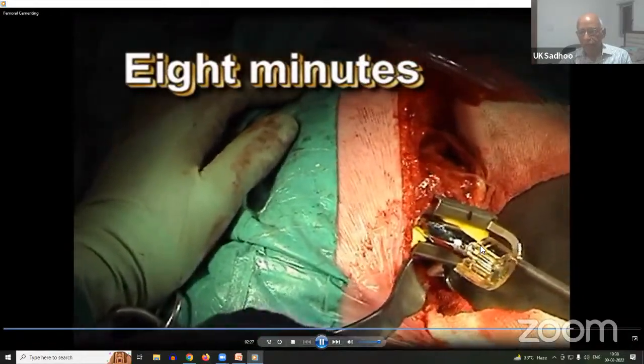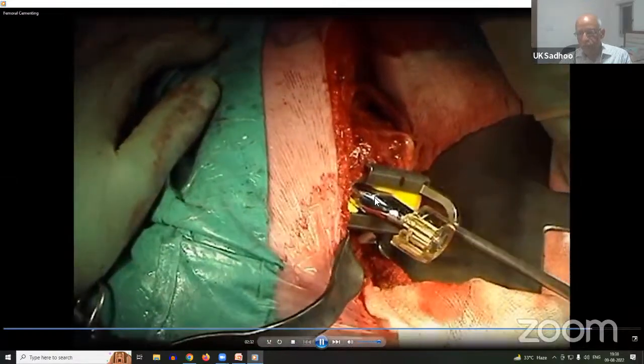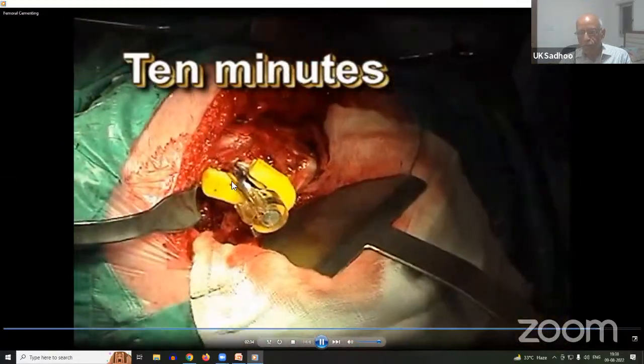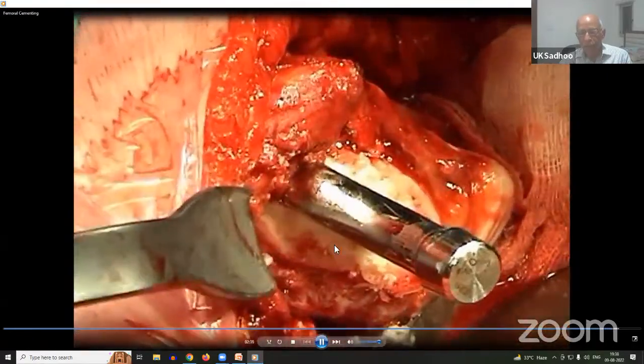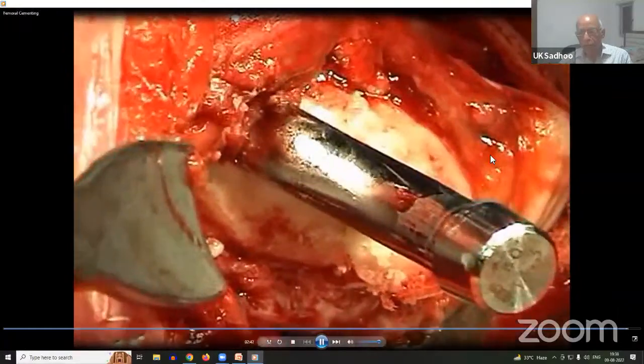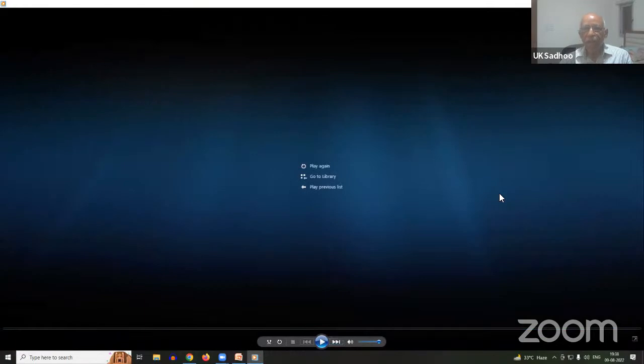And he has still not given up. He is still pushing with a U sort of seal around it. And once he is happy, there is this uniform mantle. The marrow canal contents are no longer escaping. And there you have a video which illustrates what I have already demonstrated. Okay, so I think that's the end of the message.